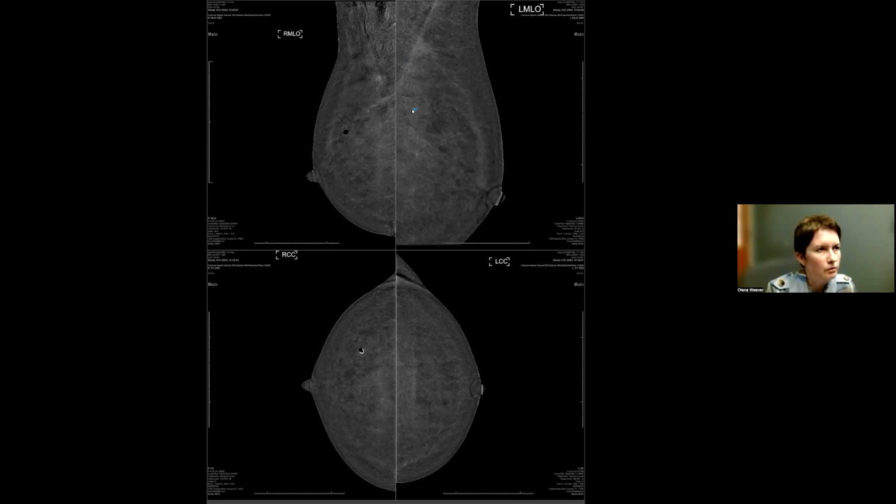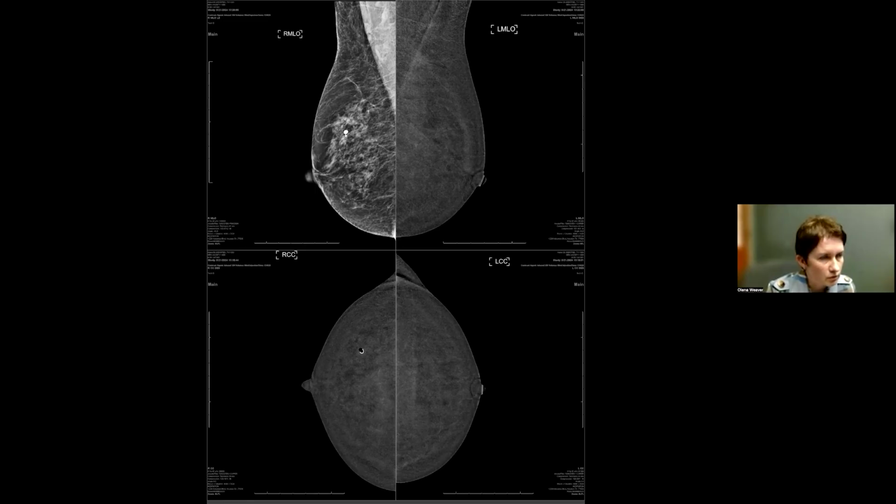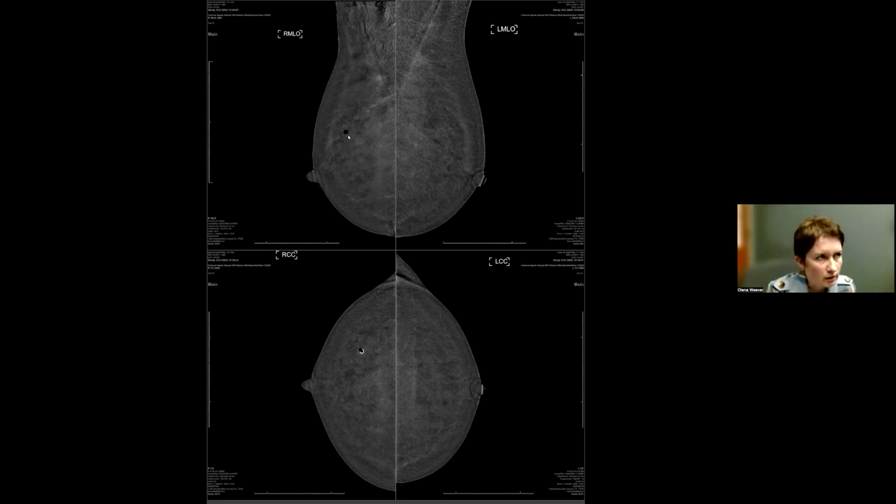So take a look. We saw that it was a heterogeneously dense breast, probably mild background parenchymal enhancement. It's still a relatively uniform gray, slightly speckled appearance. So I would call it mild. You see the dense calcification that we had on the right. It's bright white, but on the recombined image, it actually appears as a black dot. But what I wanted to point out is this enhancement.